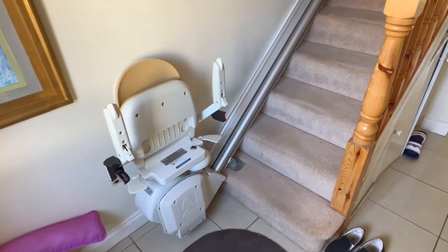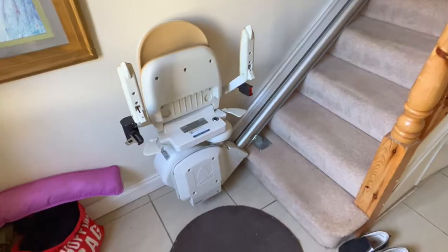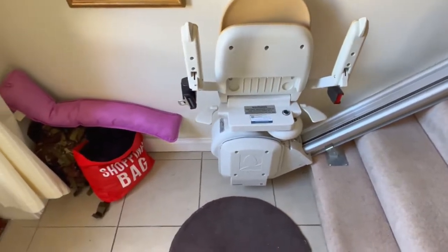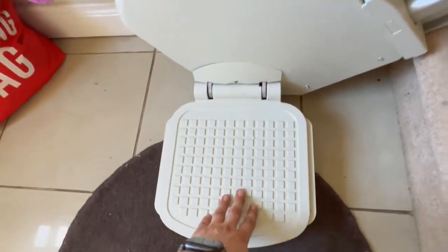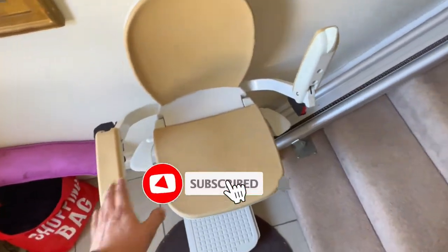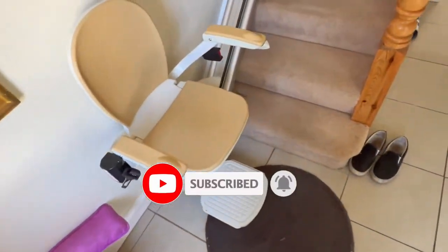Today I'm doing a demonstration of an Acorn 130 straight stair lift. This lift is built for straight stairs — if you have no turns, then this lift would be one of the suitable options. It's folded up at the moment; you can unfold it by lifting down the footrest, the seat, both armrests, and then simply sit on and you're good to go.